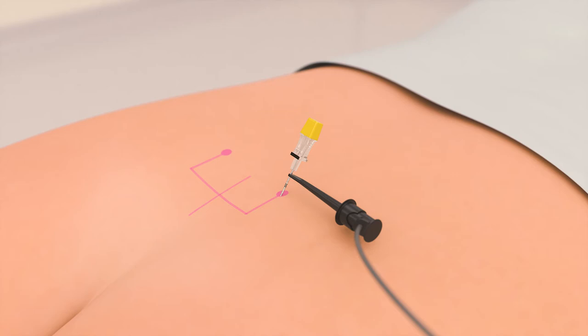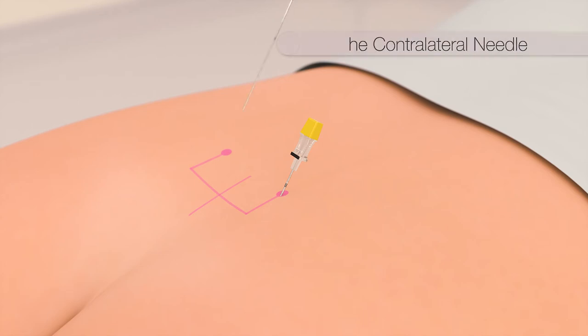This process ensures that the PNE lead is placed at the deepest location near the S3 nerve. The needle entry point for the contralateral side can be reassessed by measuring 4 centimeters lateral from the existing needle. The contralateral needle can be advanced, matching the angle of the existing needle. All testing should be repeated on the contralateral side.